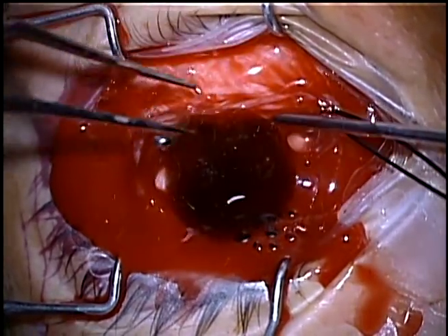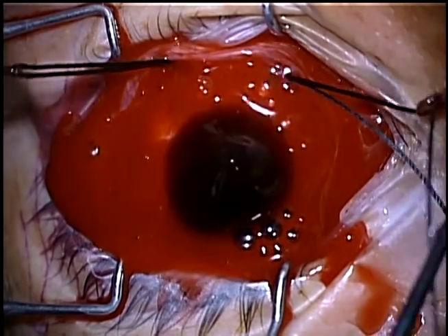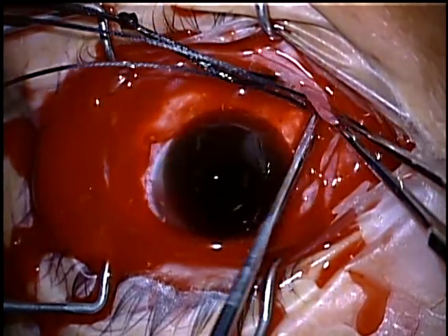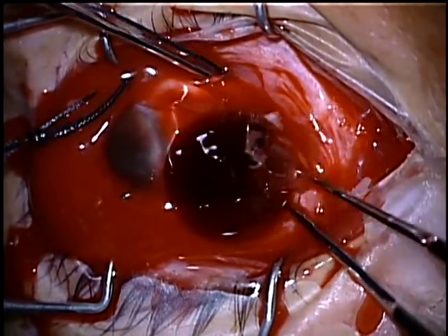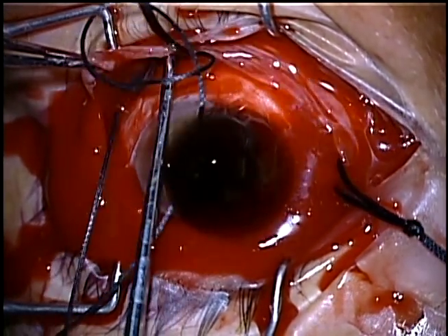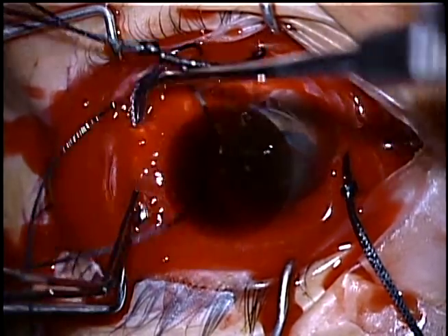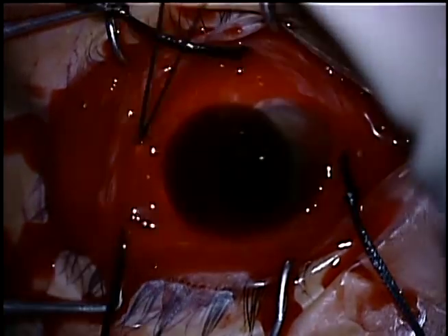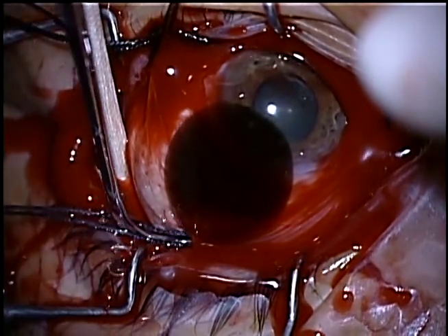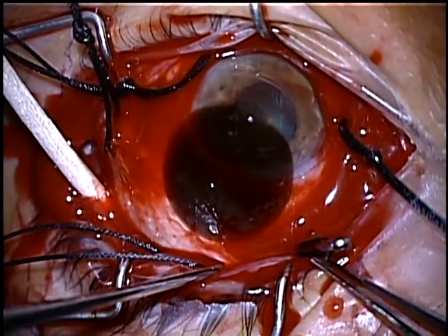Here we use an instrument to pass a black silk tie suture around the inferior rectus muscle and then tie it so we have that muscle secured. The same for the medial rectus muscle, the lateral rectus muscle, and the superior rectus muscle, so that we can turn the eye and get access to the sclera in order to prepare for the encircling scleral silicone band.